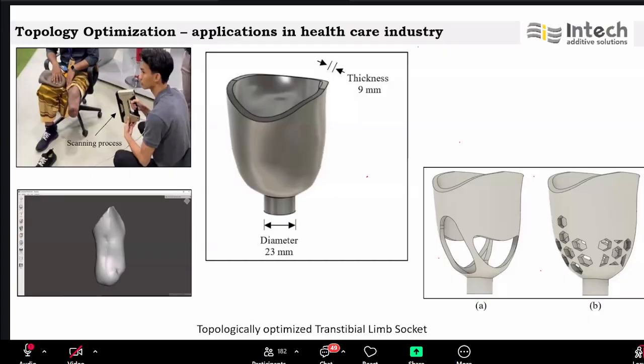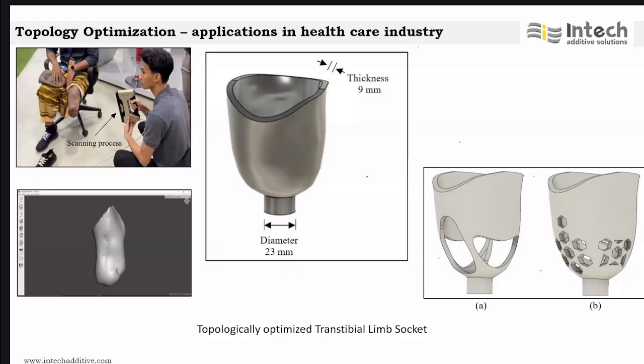One thing you can try is this: first, you have to print in metal, and then you go for polymer-based printing, like robotic polymer printing, that you can think around. First, you have to do it in metal. Once it is done, you have to take it and set it up. But again, printing on top of that could be very challenging. So how do you prepare the surface for printing and all?